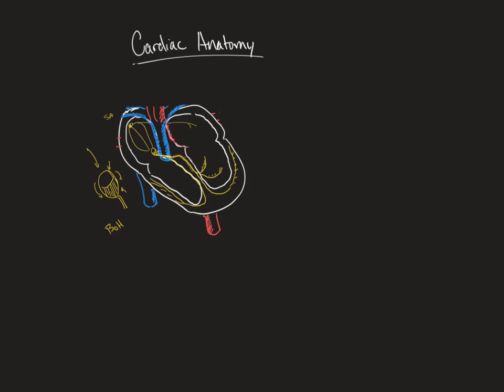you've got your isoelectric line. Let's actually draw out a nice isoelectric line. And this isn't Notability, so it doesn't straighten out. So that's not a very good isoelectric line. Let's just get working on that. All right. So we have our isoelectric line, and we have our little stop here. Our P wave is going to be pretty round, semi-flat. And we'll go over the actual measurements later.